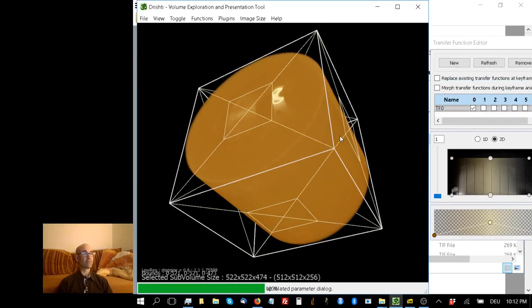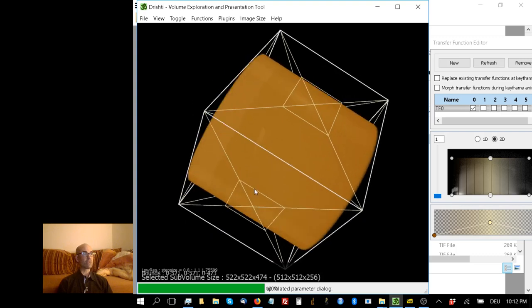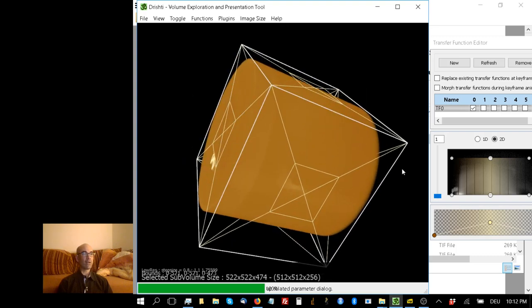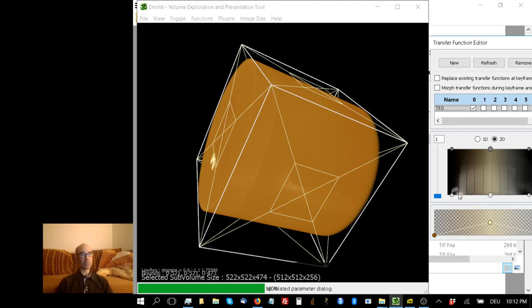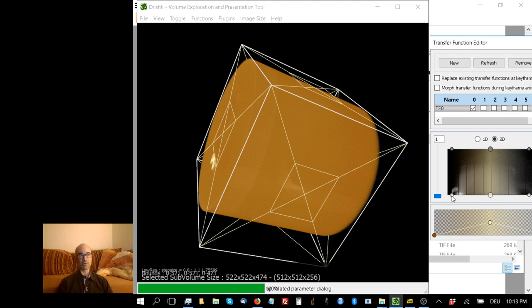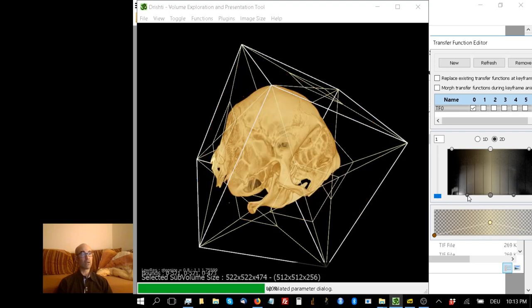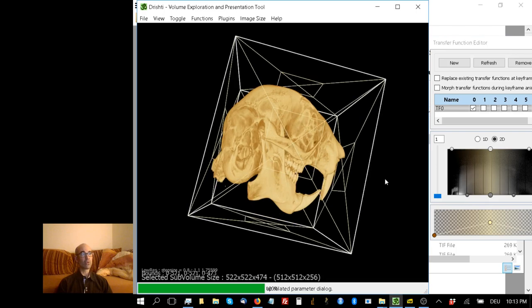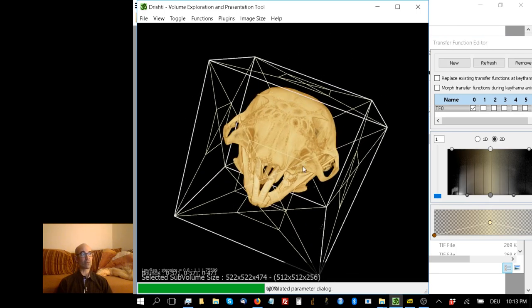At first glance, there's some sort of medium used to hold the specimen. You have to use what's called a transfer function to optimize this. This represents in two dimensions the distribution of pixel density. This concentration represents the less dense part of the scan - the styrofoam used to hold the specimen. I'm going to hold down the shift key and left-click, moving symmetrically inwards. I can get rid of the less dense voxels, and I'm left with the bone and teeth.